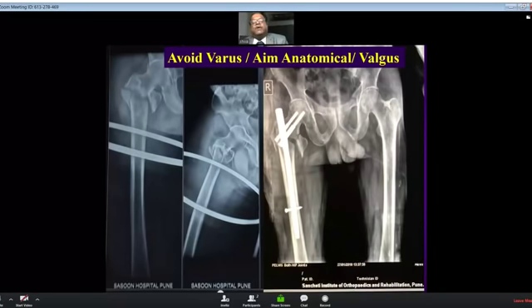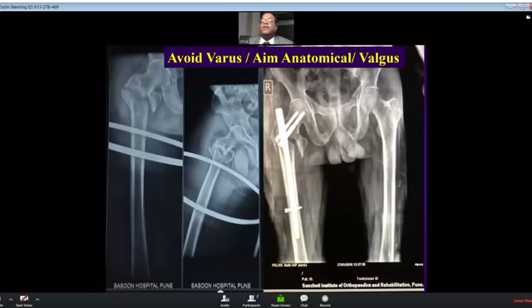So if the lateral cortex is missing, then you can get away without doing any additional thing by just tightening the screw against the nail. But the only thing, the screw should have a good head so that you can compress against the nail. That's the only requirement, because some of these screws are smooth and they might go inside. That's why I'm telling this. Not all these screws available in the market are uniform. They may not have heads.